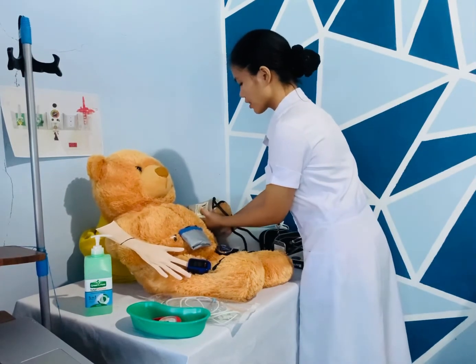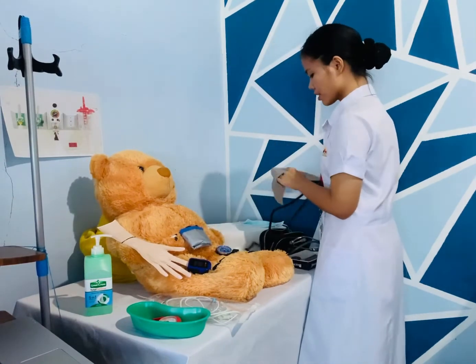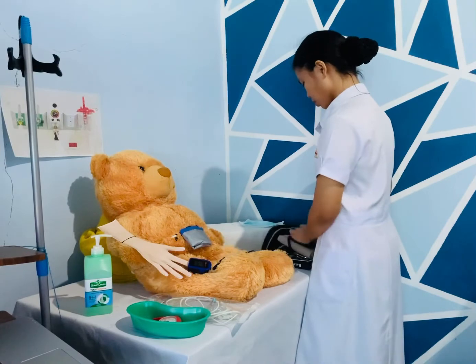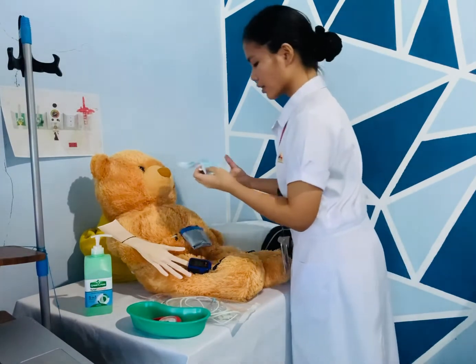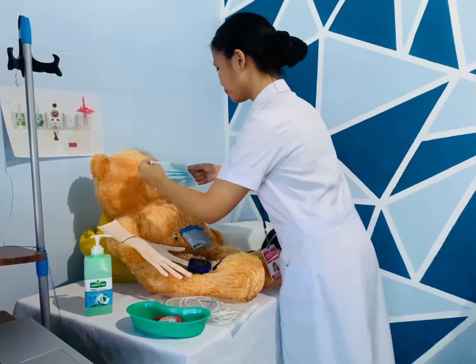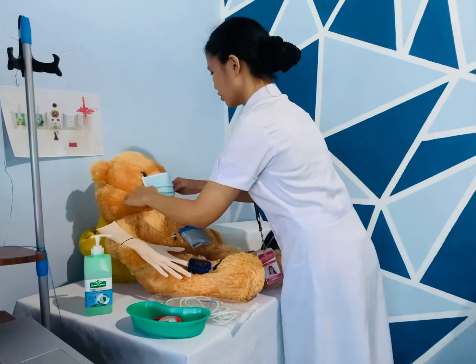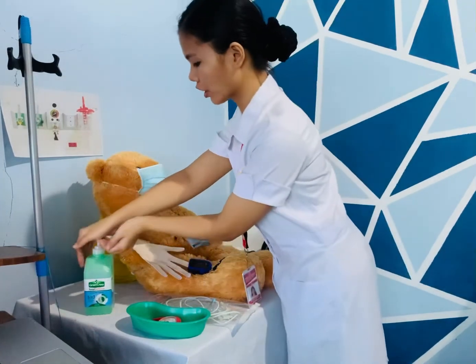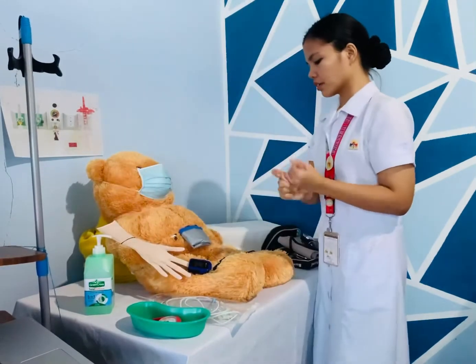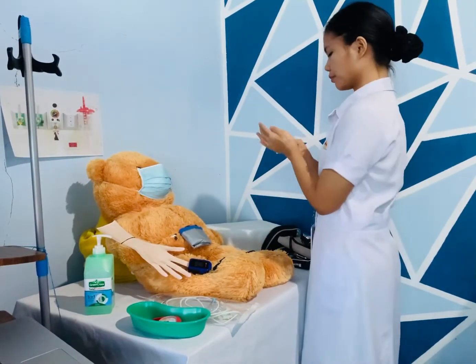Then next, I will now wear surgical mask. So, ayan, kunyari may nakasuot na ako ng mask. Then, si patient. Then, perform hand hygiene to prevent the spread of microorganisms. Then dry hands using a clean paper towel.